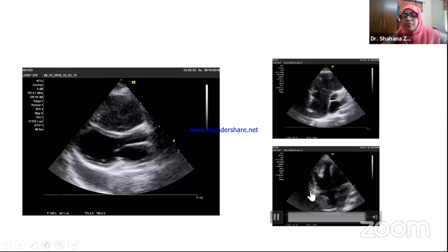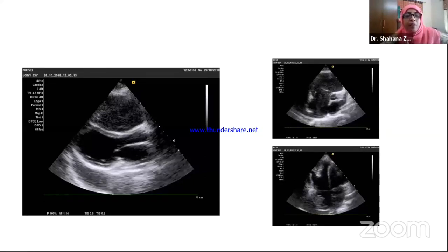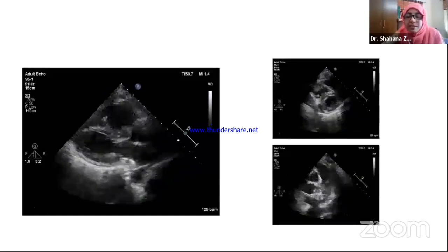The RV is minimally moving, but with all our effort and our minimal resort, we failed to make this patient survive this time.